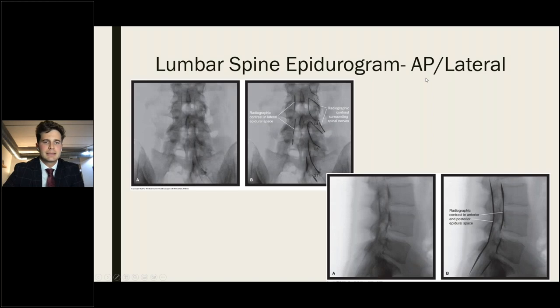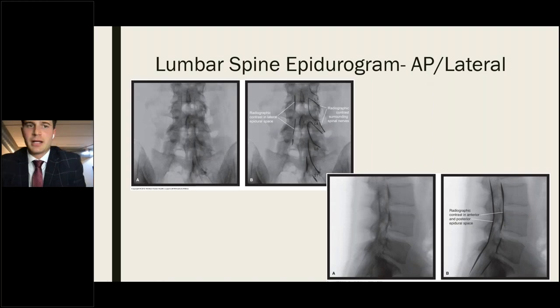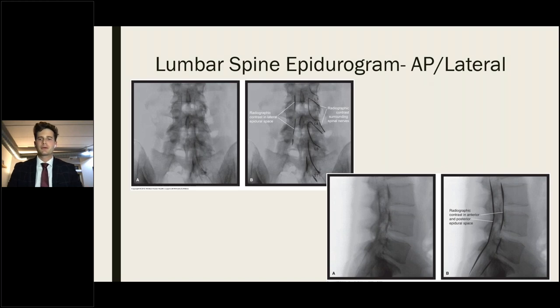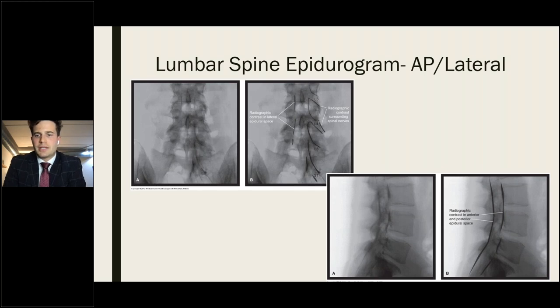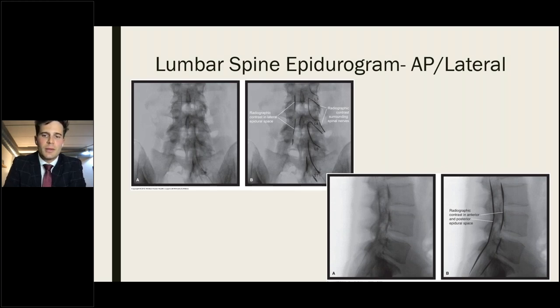An epidurogram using radio contrast confirms epidural needle placement. In AP view, contrast spreads to the lateral borders of the epidural space through the neuroforamina, surrounding the spinal nerves. If a neuroforamen is severely stenotic, there may be absent contrast spread at that nerve root. In lateral view, contrast appears in both anterior and posterior epidural spaces, confirming the three-dimensional nature of the epidural space.